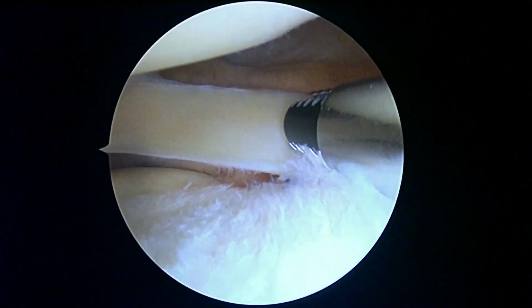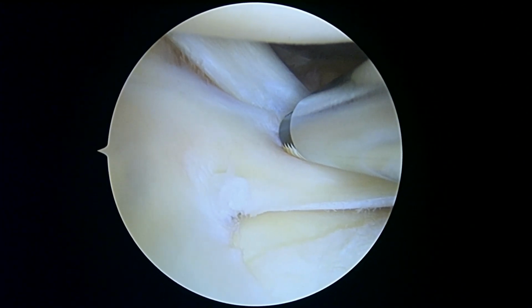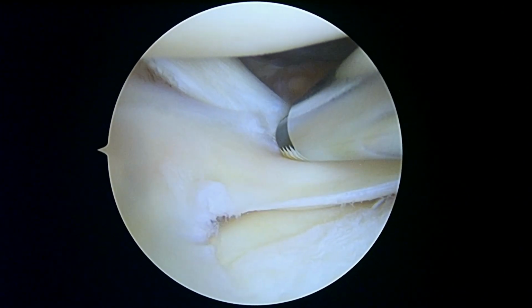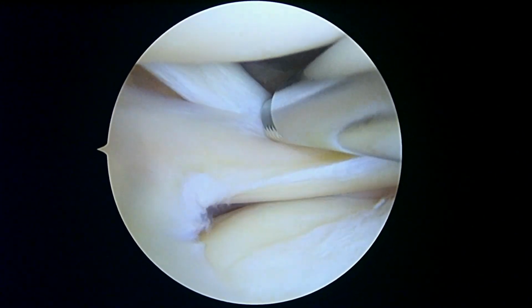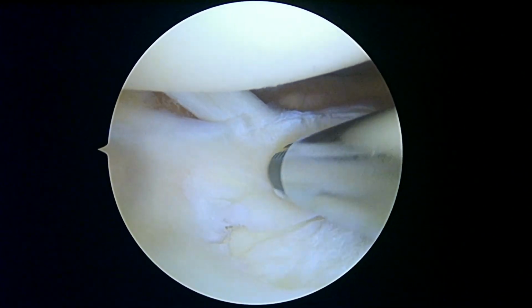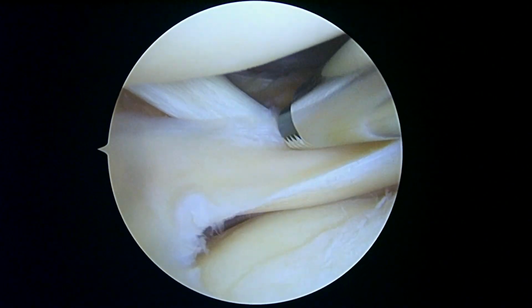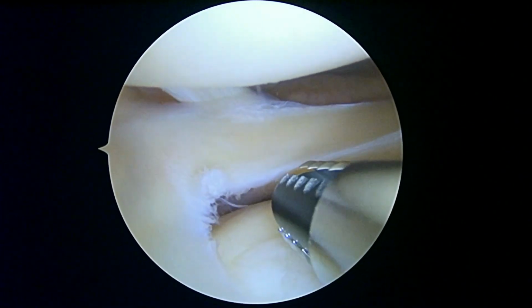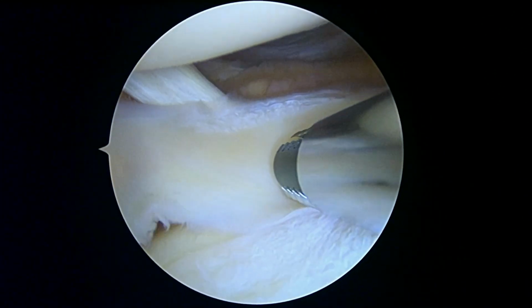So this is, you see that? So this is posterior horn of the lateral meniscus. Behind the meniscus there, that's the popliteus tendon. The popliteus runs up in your right knee. It runs up towards about 11 o'clock on the screen. I'm touching it right there behind the meniscus. There's an area right in front of the popliteus where the meniscus is not attached to anything. That's called the popliteal hiatus. That shows up on test questions sometimes, but that's a normal thing.